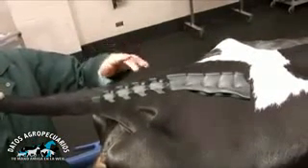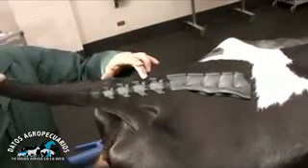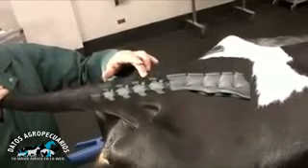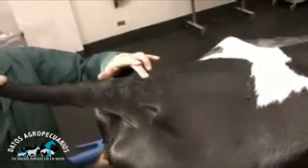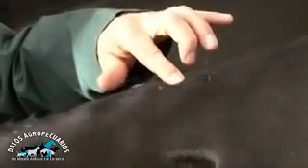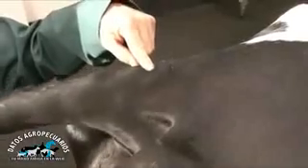This space is identified by gently lifting the tail up and down while simultaneously palpating for the first freely movable joint, caudal to the sacrum. Once the proper site has been identified, the area should be clipped and surgically prepared.